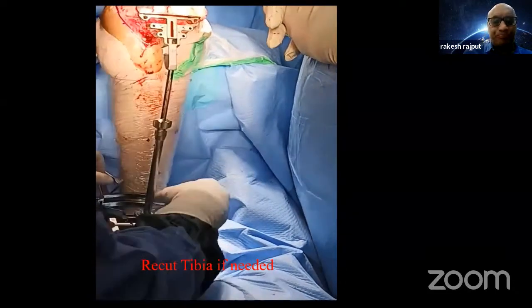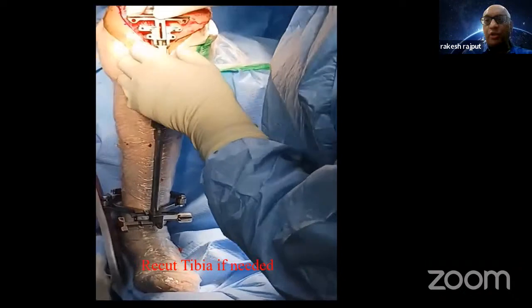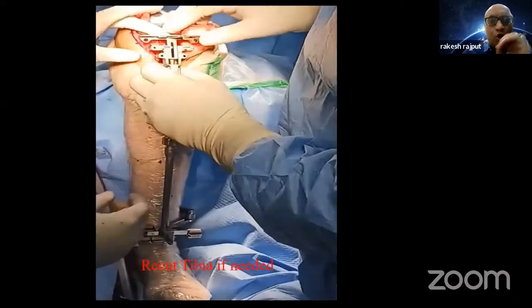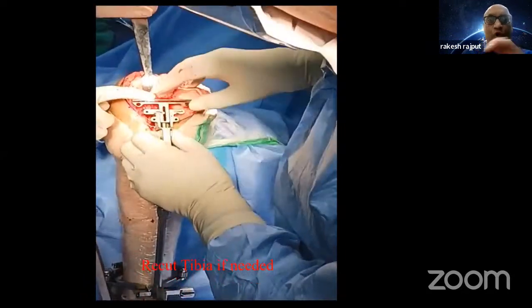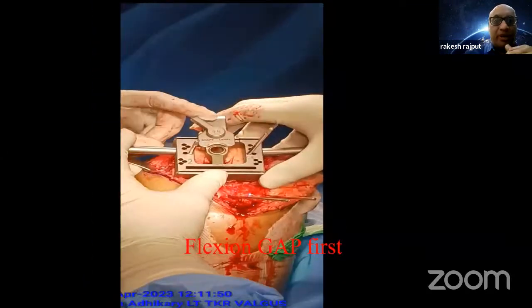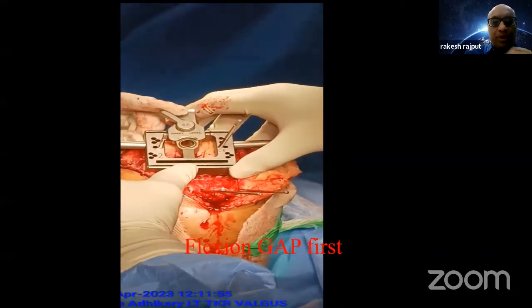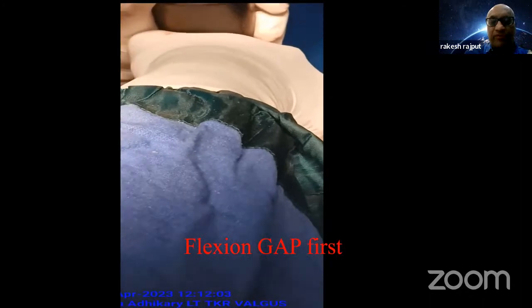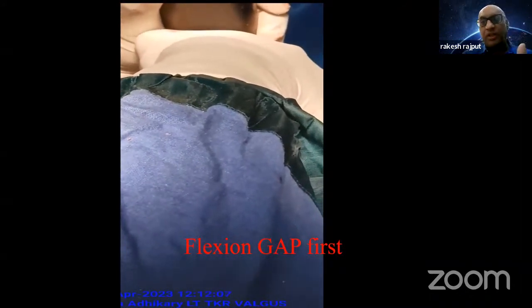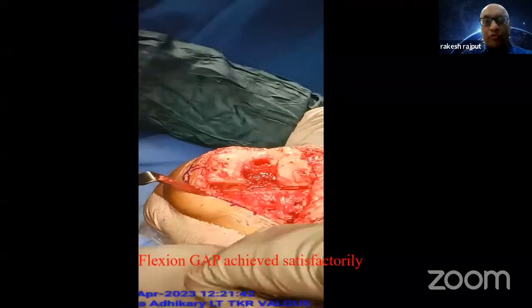So reapply the jig. It's a very easy process of recutting the tibia enough to get that spacer in comfortably with a very gentle hammer. It should slide in very easily and not be hammered too tightly. So you get your tibia cut properly done. Next you move on to do the proper femoral cut. So here what you're looking at is the flexion gap. Now you've checked your flexion gap and you're going to do the flexion cut and also the anterior cortex cut. That's what we are doing. So we'll move on from there.